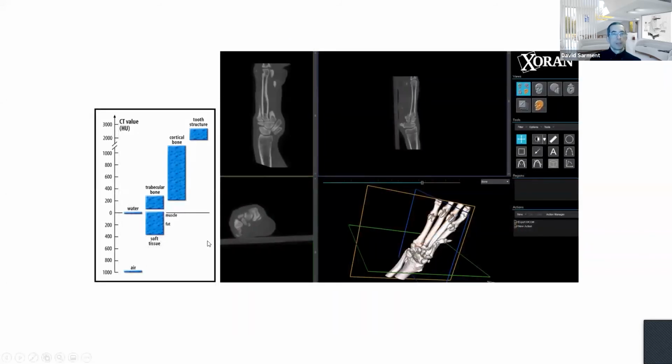We also take this information and assign it a gray value. Those are ultimately presented in what we call a multiplanar reconstruction view, which is cuts in different directions, in gray values. And we'll look at that again in a moment. And this is very arbitrary, by the way. The reason why we do it this way is because that's how CT scans started back in the 70s, and traditionally we present it this way. And by convention, we keep up with the anatomy layout on the screen so that it's consistent over time. That's really the main reason for presenting it in this particular way.